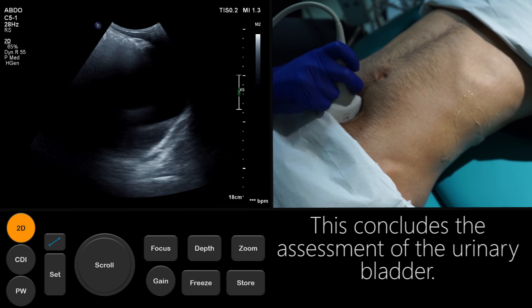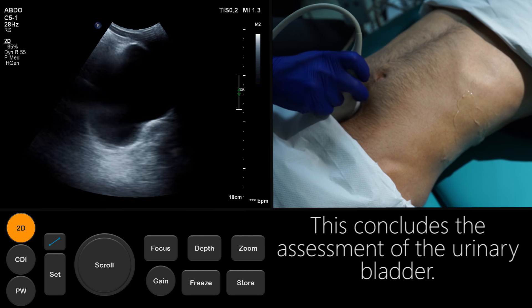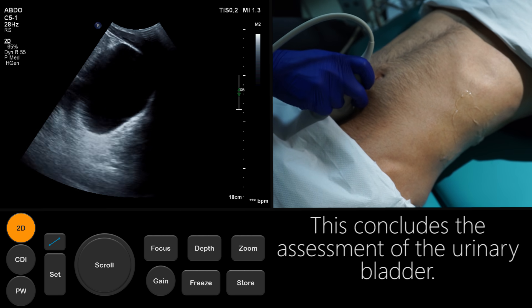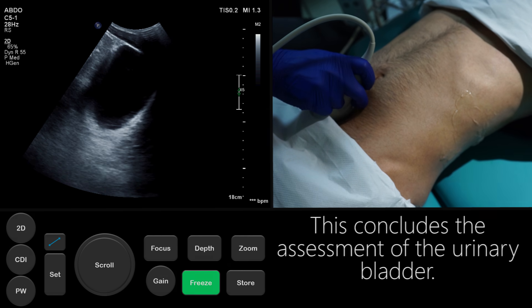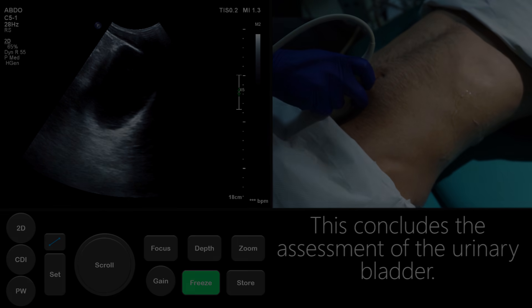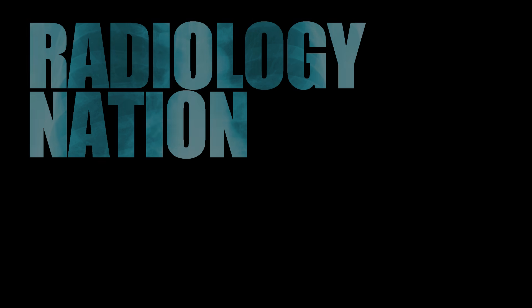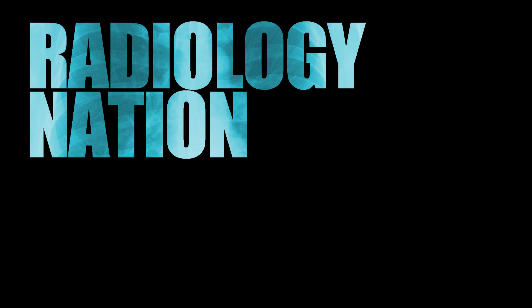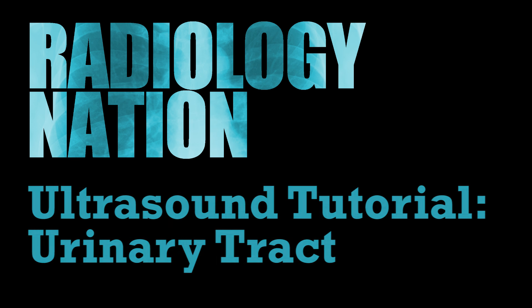This concludes the assessment of the urinary bladder. Throughout this video, we have demonstrated the technique for ultrasound assessment of the urinary tract, highlighting the relevant anatomy and pathology along the way. This should provide the basis for you to practice and perfect your own method.